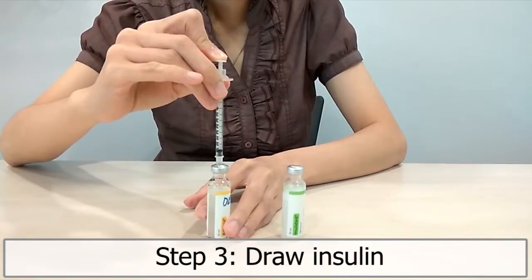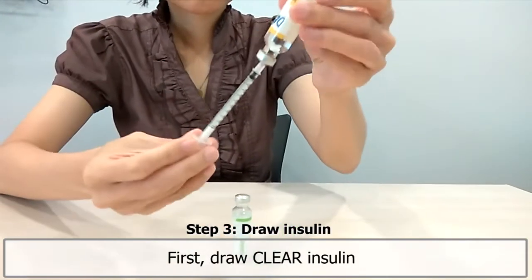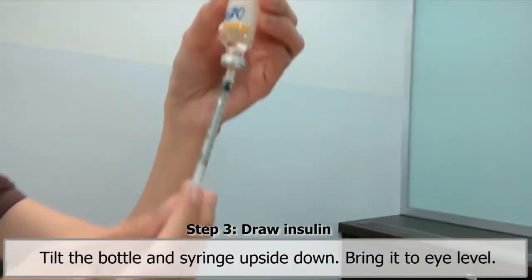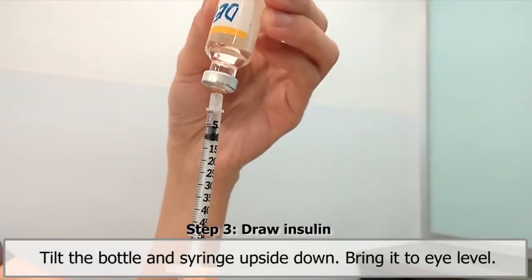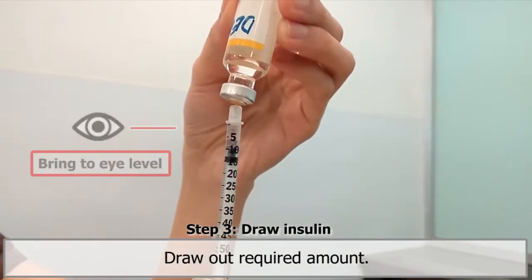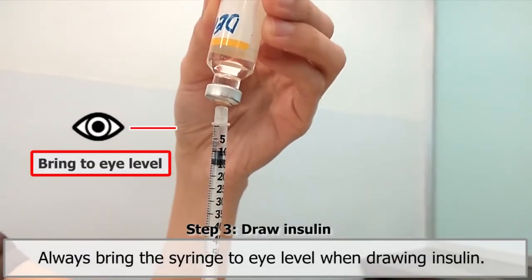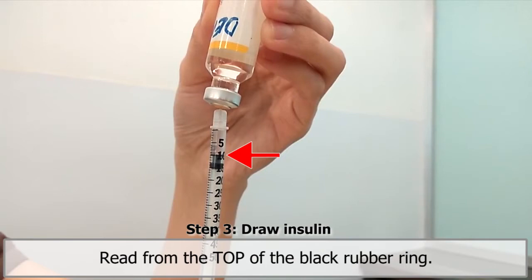Step 3. Draw insulin. First, draw clear insulin. Without removing the syringe from the previous step, tilt the bottle and syringe upside down and bring it to your eye level. Draw out the required amount of clear insulin and remove the syringe. Always bring the syringe to eye level when drawing insulin. Read from the top of the black rubber ring.